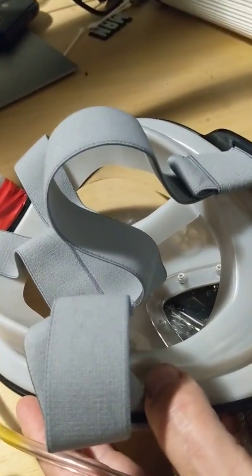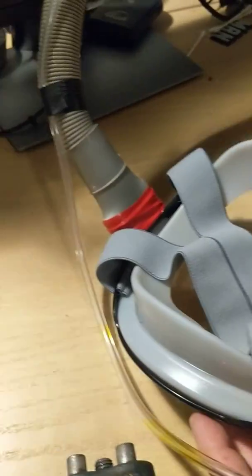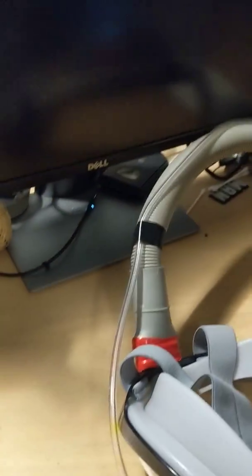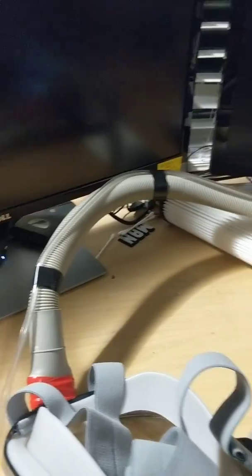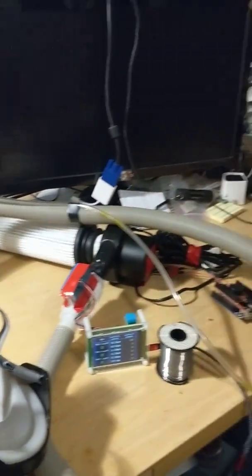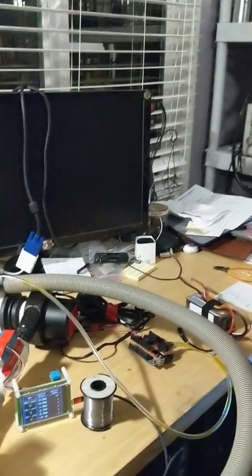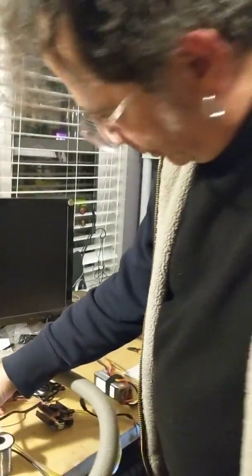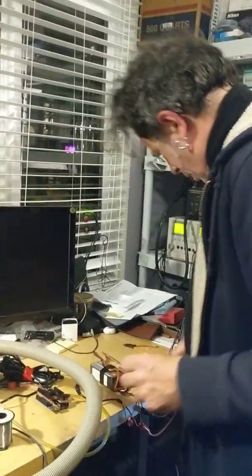And then, you notice when I take it back off my face, the alarm sounds again. When I take it off, when there's a leak in the hood, the alarm automatically sounds. And you notice the air quality was drastically improved.